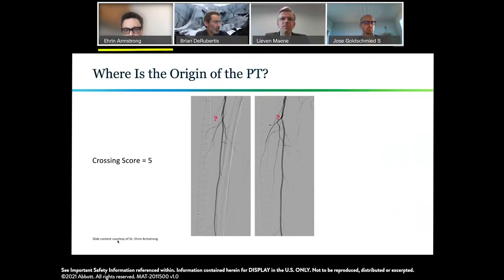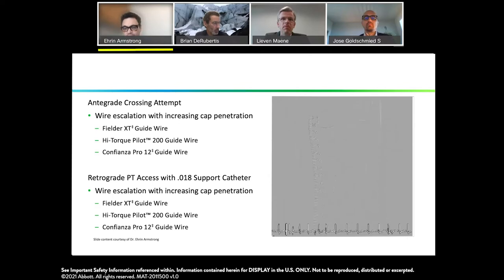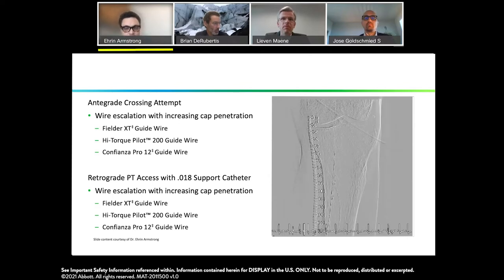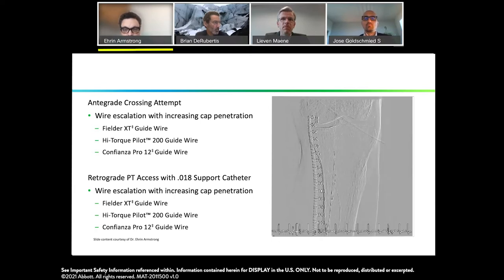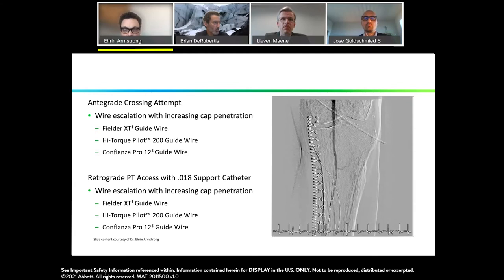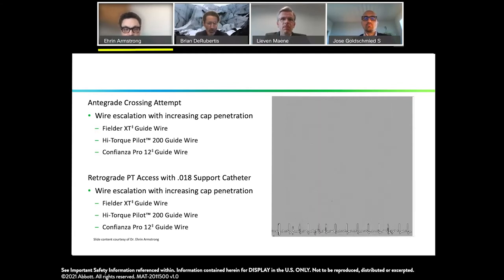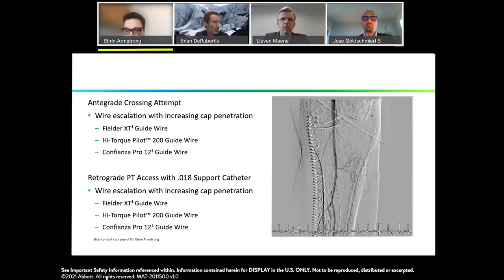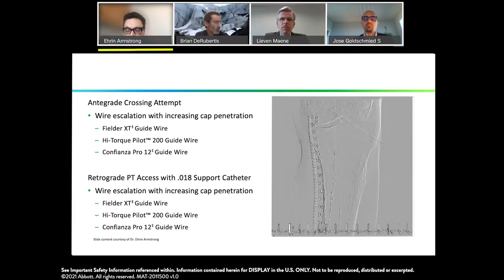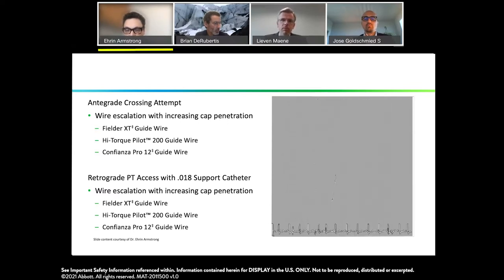These orthogonal views again emphasize that there's not a clear cap of the posterior tibial to probe. This would be a crossing score of five based on the system just discussed, suggesting this is not going to be amenable to an antegrade approach. Consistent with that, I tried from an antegrade approach using a wire escalation strategy — starting with a softer-tipped 014 Fielder XT wire, then escalating to a Pilot 200, then a Confianza Pro 12. In each case I was able to engage what I thought may be the cap, but was not able to gain much traction, consistent with either not being in the cap or the cap being very tough. Without a clear target, it was difficult to proceed from an antegrade approach.